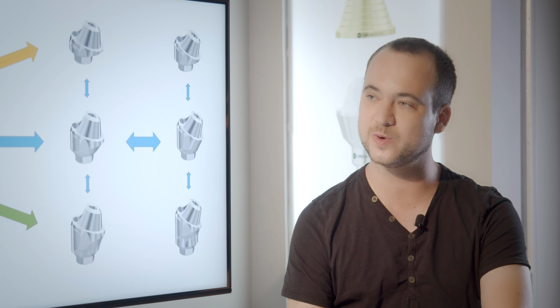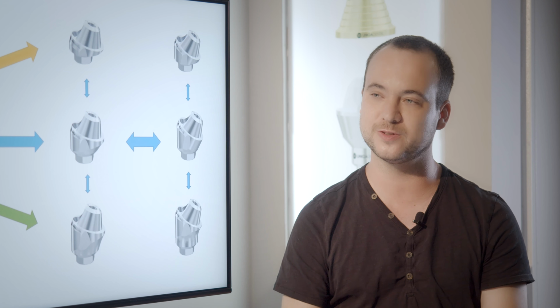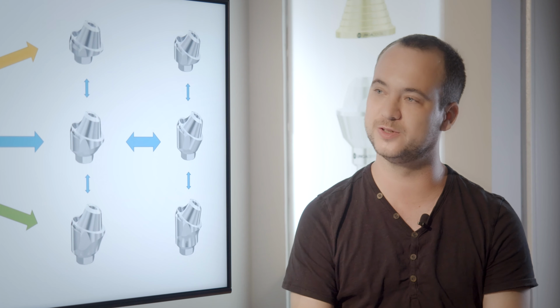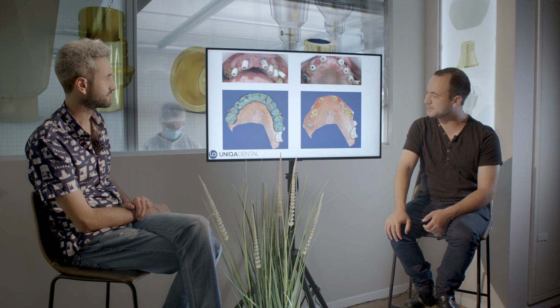You'll just get lost when you try to position all the different multi-units in different places, and you don't know where the problem is, and you just don't know what to do. Here we can see that eventually, for the implant-level multi-unit that was taken, we chose to do a straight multi-unit to avoid the buccal bulge.